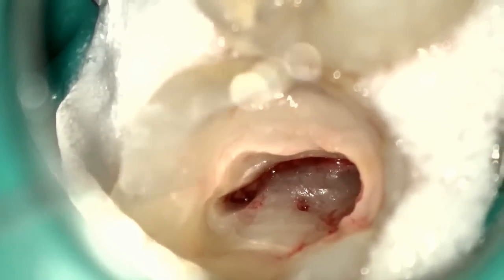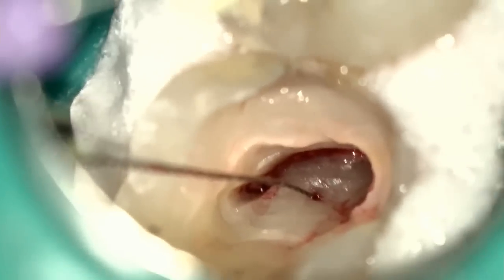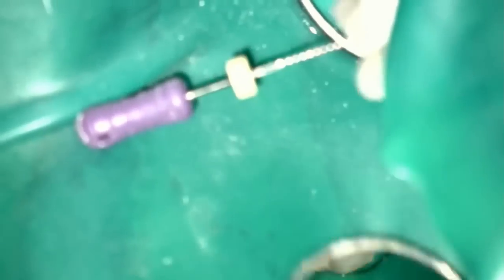You'll see here I pre-curve a number 10 file, and it's going into that distal buccal canal orifice. I use a watch-winding motion to get down there.